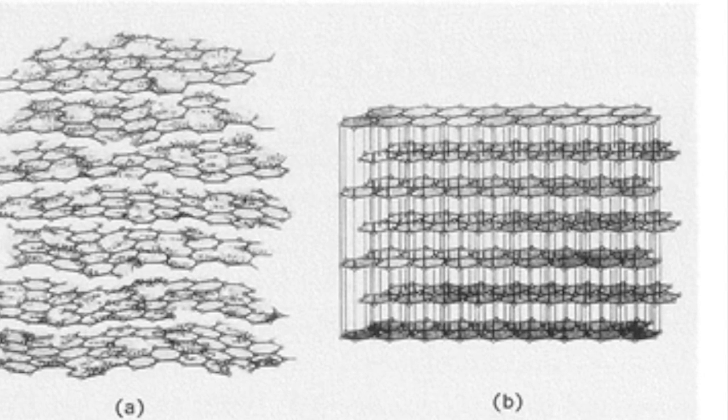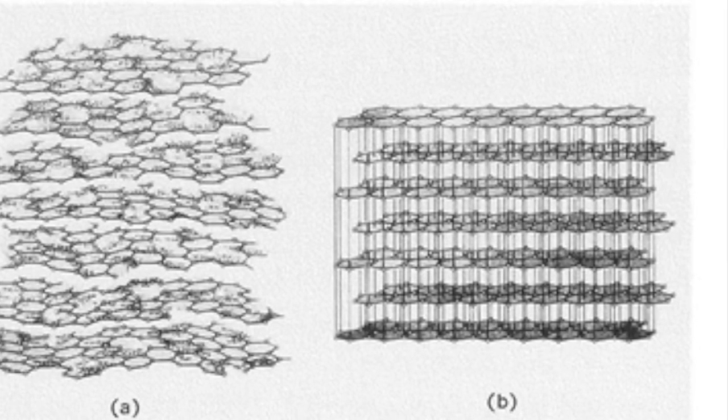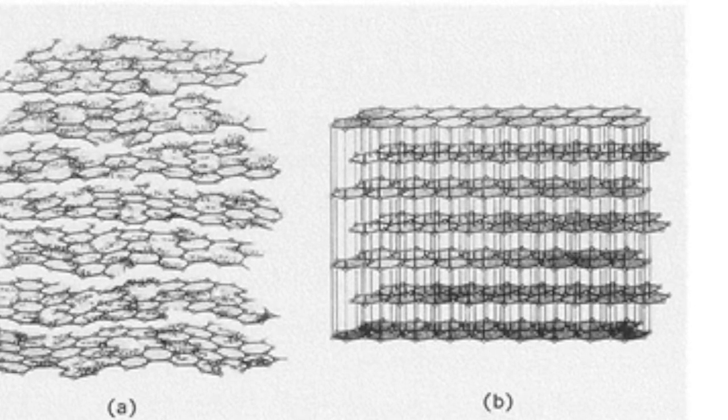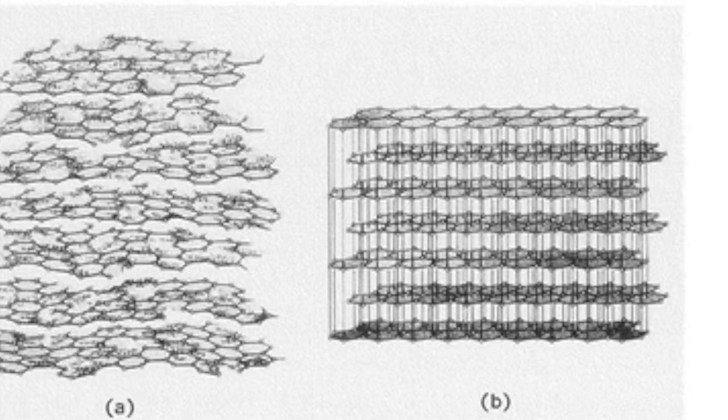Specifically, bileaflet or trileaflet valves often include pyrolytic carbon as a coating on the gated portion that regulates blood flow, as well as the portion that supplies structural support to the body of the valve. The next section will elaborate more on this utility.